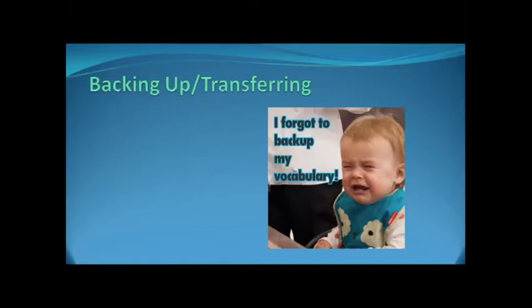Backup and transferring. If you don't know how to do this, it's really, really easy, and it's really important. I just heard about a student recently who got into the library and actually deleted his whole file because he was curious and looking at the rest of them, and lost his whole file. That was kind of sad. They didn't have it backed up.